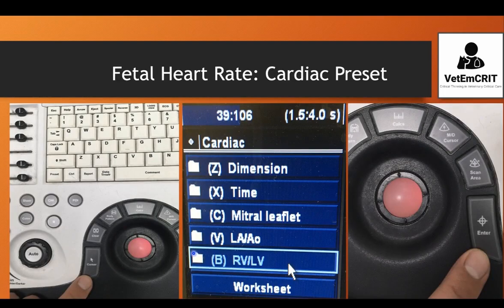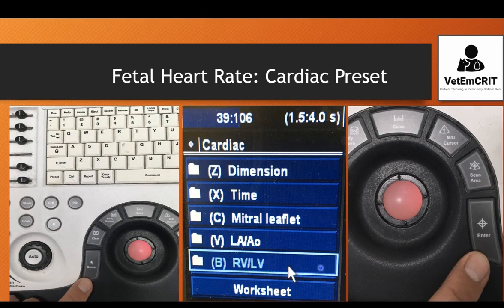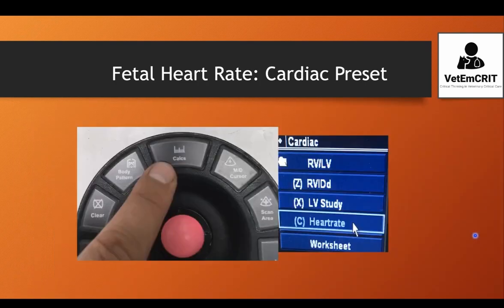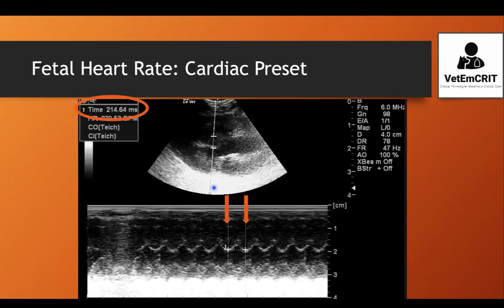The next step to get the fetal heart rate on cardiac preset is to choose the RV/LV study and then confirm your selection. Next, you will see an option called heart rate, which you confirm by clicking on calcs and enter.